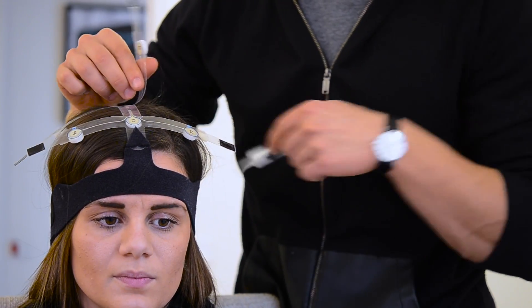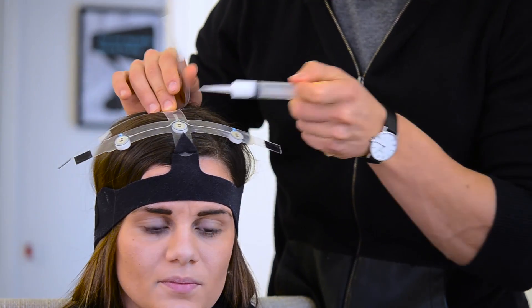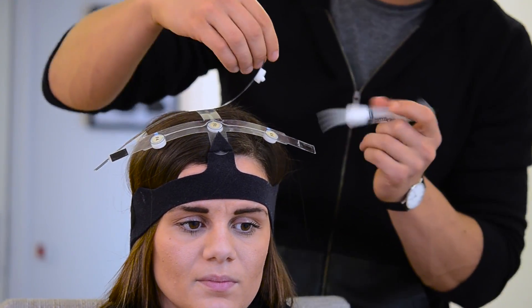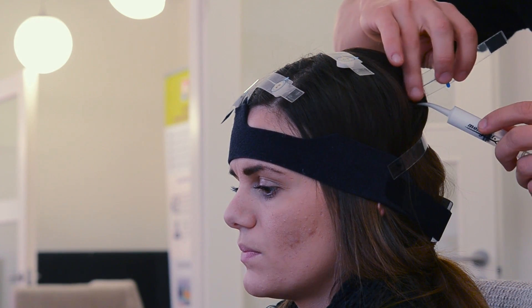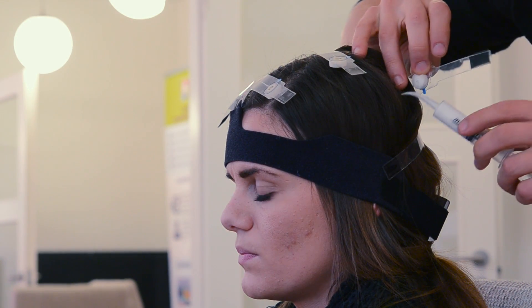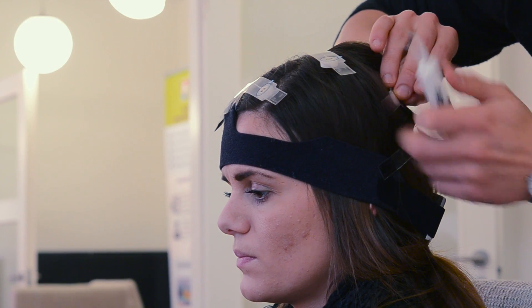And to get the desired connection, we have to make sure that every passive electrode is placed correctly. Each of the nine passive electrodes has to have a stable connection, and therefore we use this plastic syringe filled with our conductive cream, which is appropriately shaped for us to take past the participant's hair, so that we can get as close to the scalp as possible to ensure the connection.